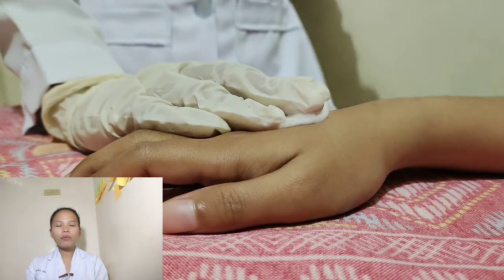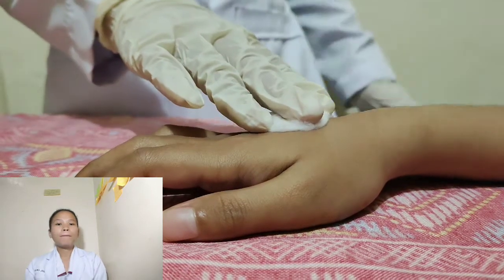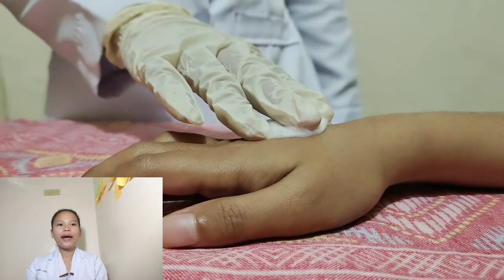Immediately apply firm pressure to the site using the swab for 2 to 3 minutes. Pressure helps to stop the bleeding and prevents injury to the vein. Hold the client's arm or leg above the body if bleeding persists. Raising the limb decreases blood flow to the area.